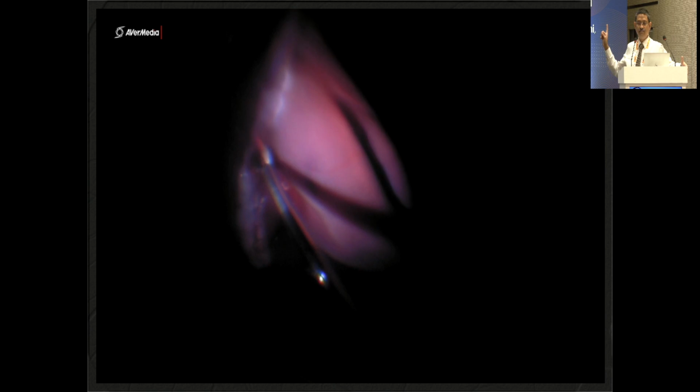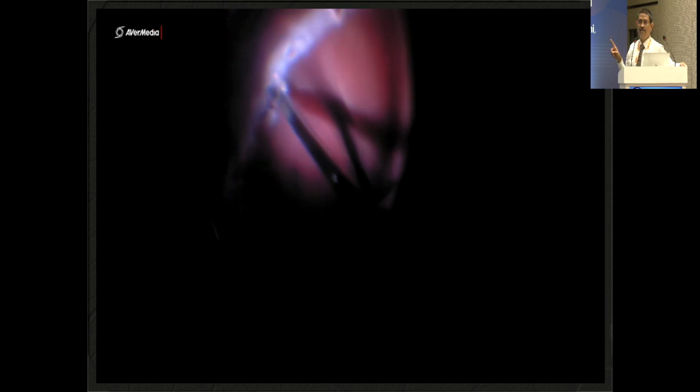retinotomy. But before doing the retinotomy, you have to give this injection, otherwise the TPA will come out, so there is no point in giving it. I have done the cauterization in the periphery. This takes a little longer, but it is worth using the scissor and cutting the retina precisely, so that once you put it back, it comes much easier, instead of using a cutter. If you use a cutter, there is always a tissue cut.